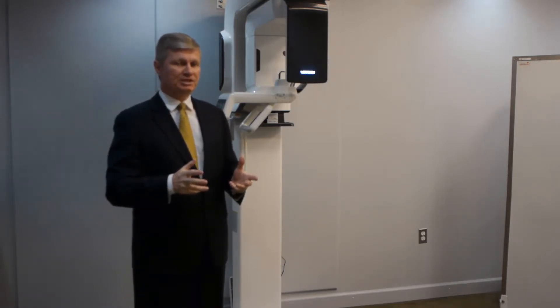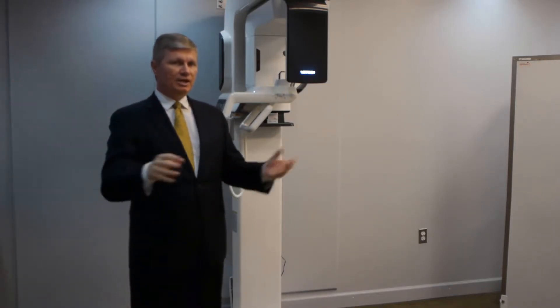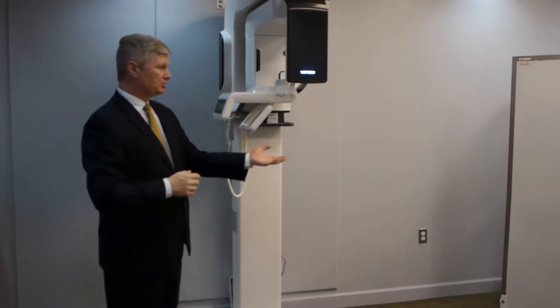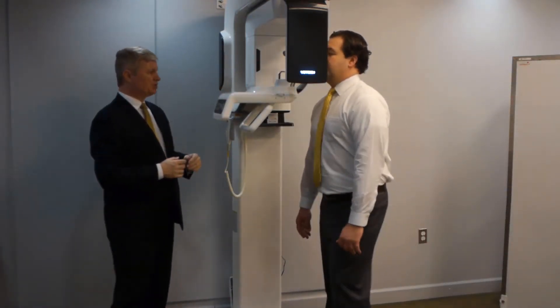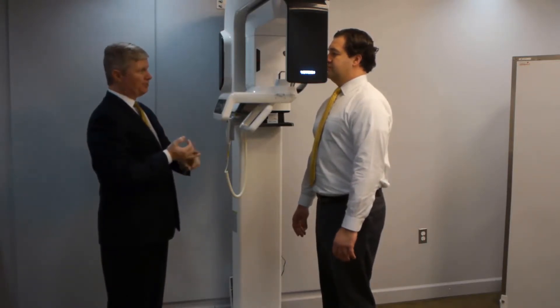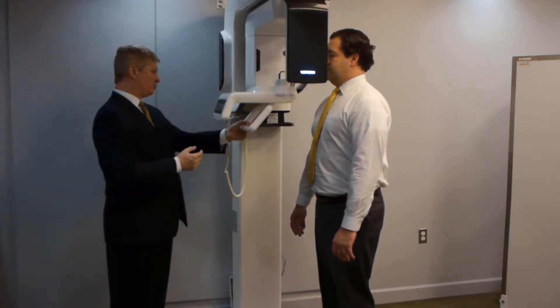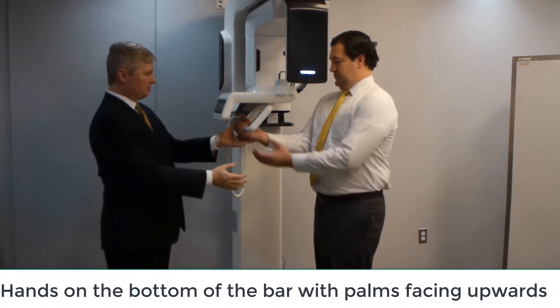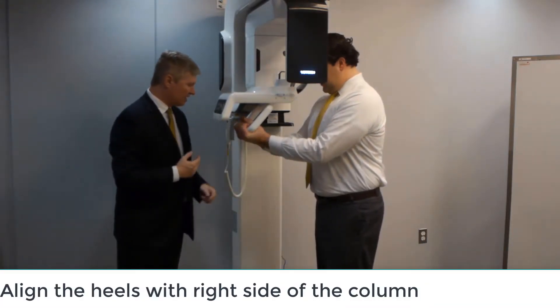In this video tutorial, we're going to go through the setup and image capture doing a 3D scan with a PaxiSmart device. I've configured the capture software itself and now I'm ready to position our patient. We're going to focus on where your hands are going to be, where your feet are going to be, and then where your mouth is going to be. The first thing is to put your hands on the bar here, palm facing the bottom, up towards the ceiling. You want your heels to line up with the right-hand side of the column.